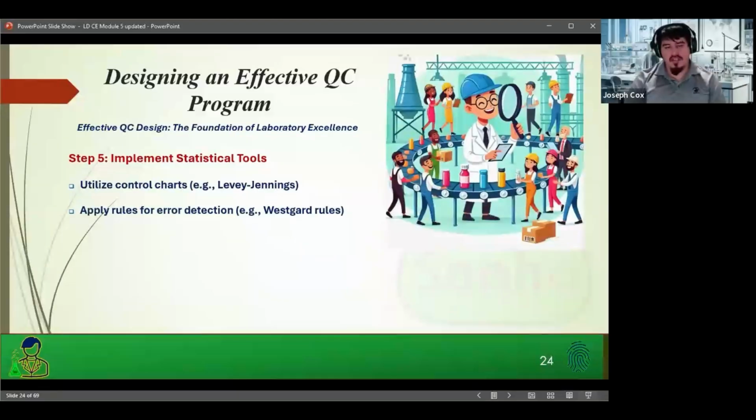So basically, Westgard rules is statistical analysis for natural variation. So there is natural variation within your instrumentation. If it's random, then it's fine. If you're identifying trends, then it's a problem. So if there's trends, or if the random is too much, like the 4SD. If you're positive or negative 2SD out, one's high and one's low, then there's no trend. You don't have a calibration curve. You just have a system that's throwing out numbers. So it's important to have those things.